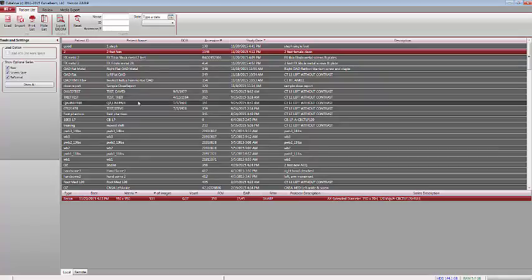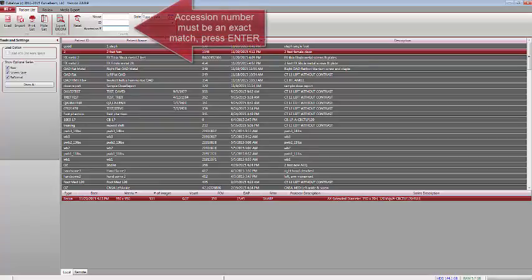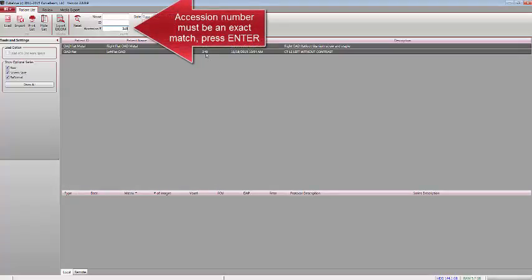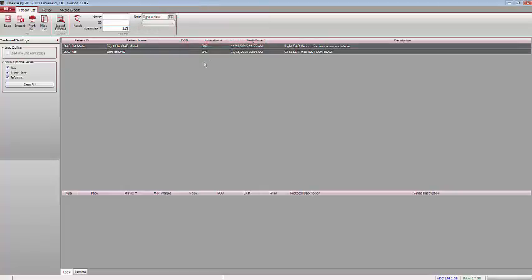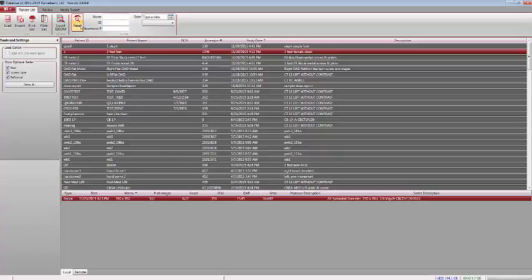Another new feature available for customers using packs and worklists in their practice is an accession number search. You enter the exact accession number, press Enter on the keyboard, and your list immediately narrows down to only those accession numbers that match what you entered. You can press Reset to get back to your full list.